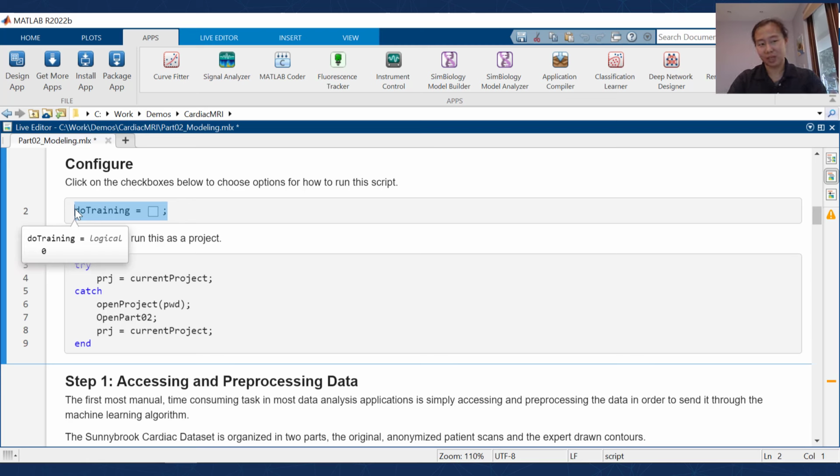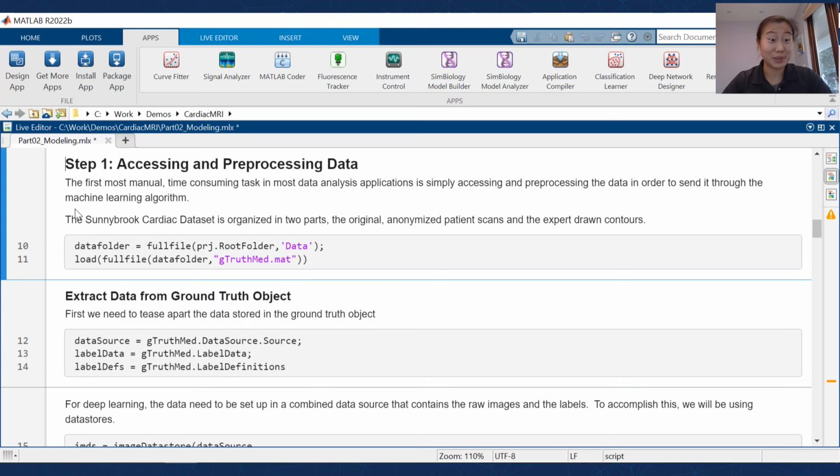I've done it so many times already, but this particular training takes at least 6 hours, so we are not going to do the training live today, but you will get the code and instructions for how to get the data set. So if you are interested in performing the training yourself, have at it. I strongly recommend using a GPU.